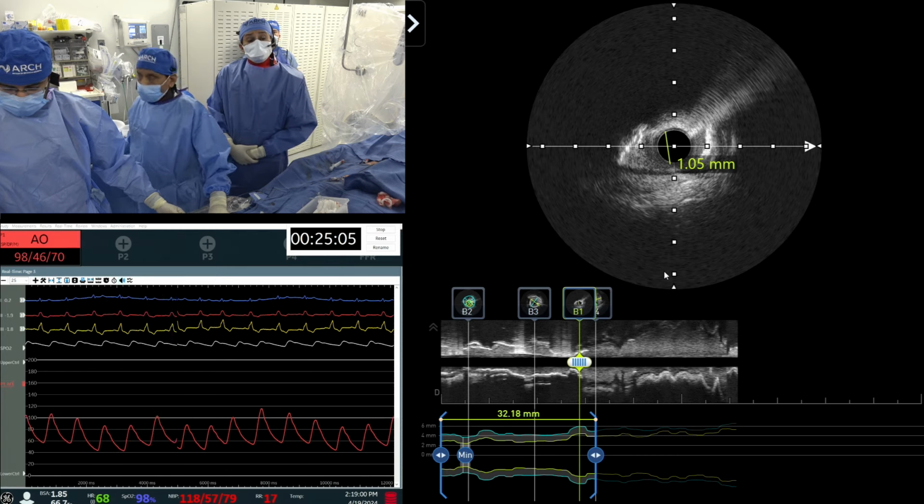Play it again. Now the question is to the panelists. We understood, it's a run of the mill case. Guys, pay attention or sleeping? Good. Okay. Let me do it. Look at the calcium even before the dye. Go to the previous one. Look at how dense the calcium in the diagonal is. The question will come.